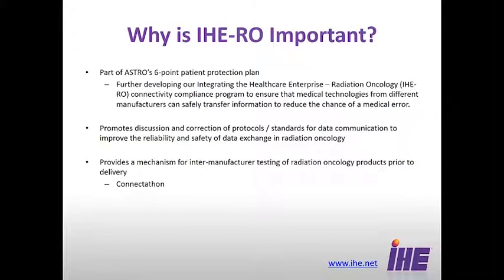It is a way we think to help with patient safety and with efficiency in the clinic. One of the things that as a vendor I particularly enjoy is the last point, that it provides a mechanism for different manufacturers to sit down and test with each other live, and we do that through the Connect-a-thon. I find that to be one of the most important aspects of it as a vendor.